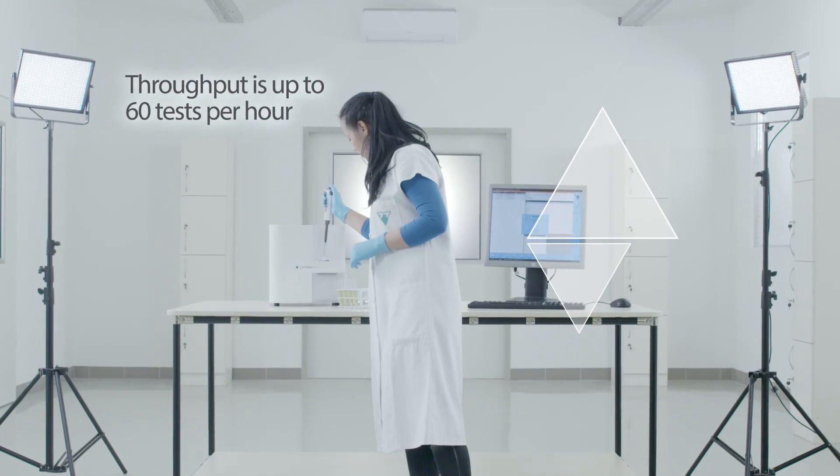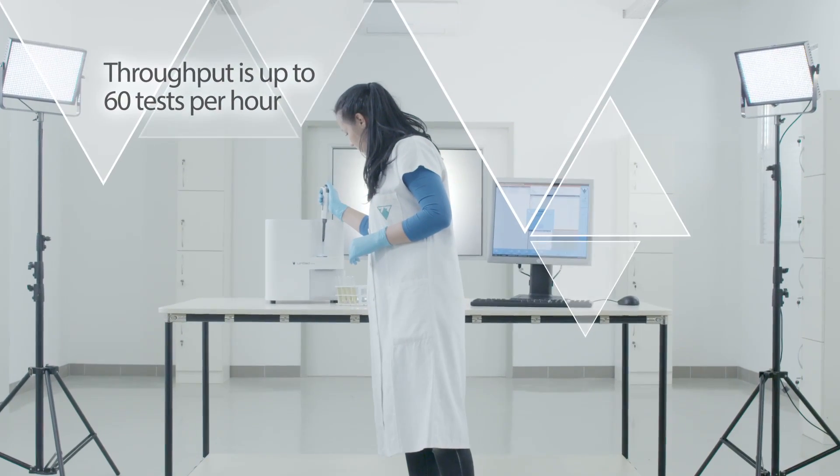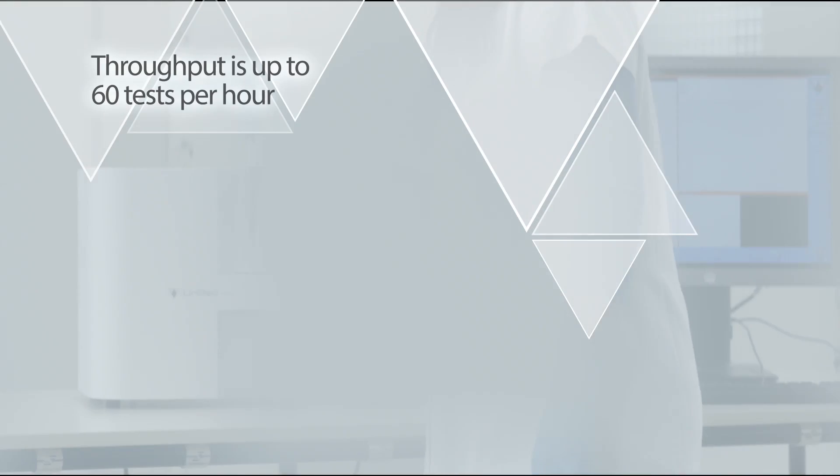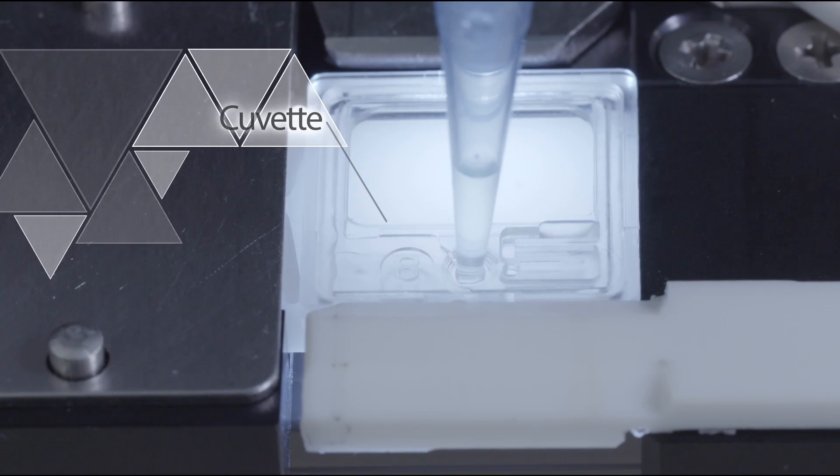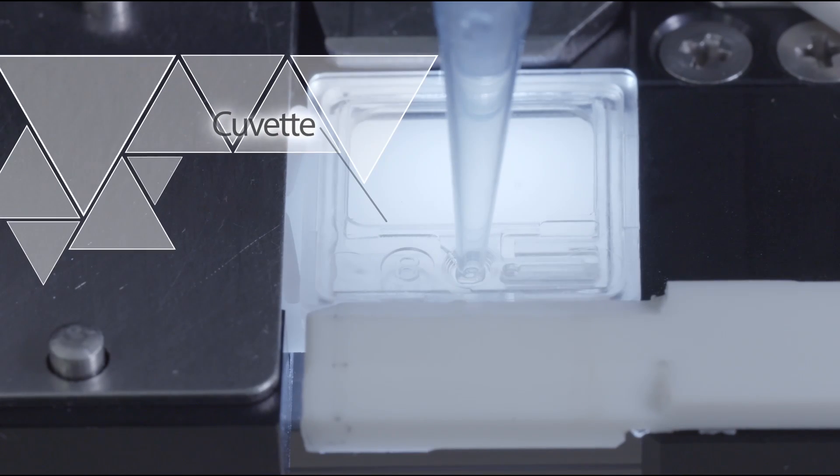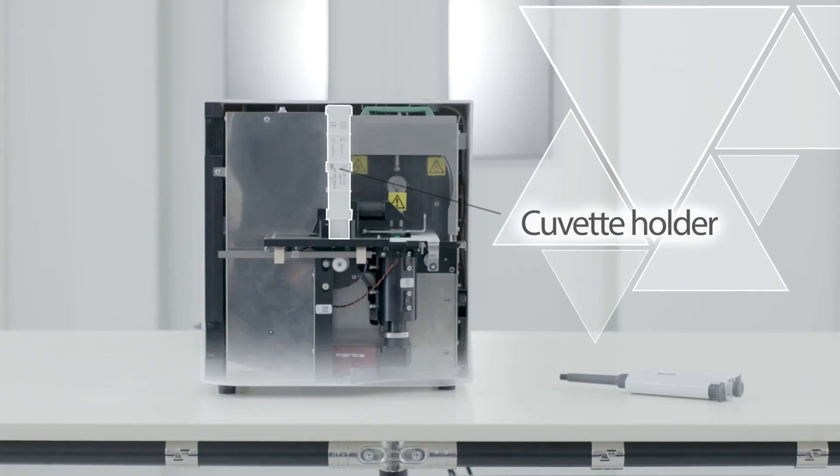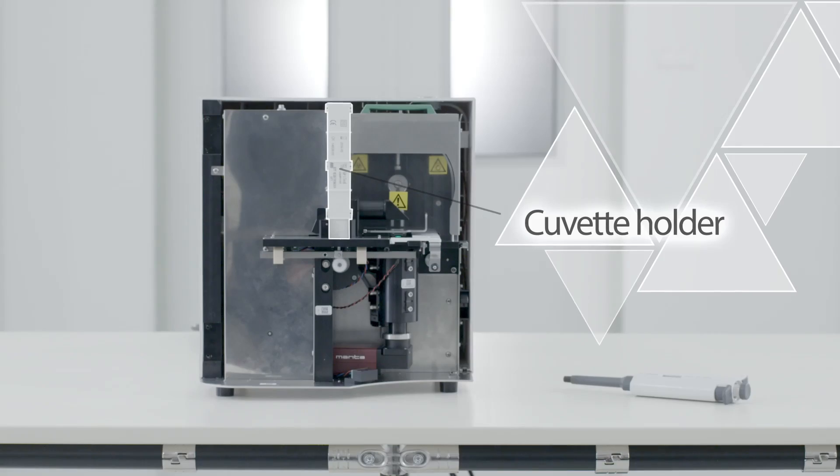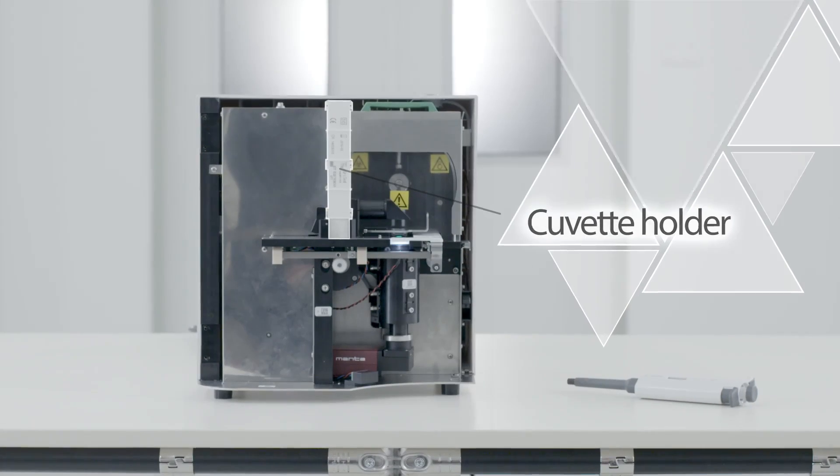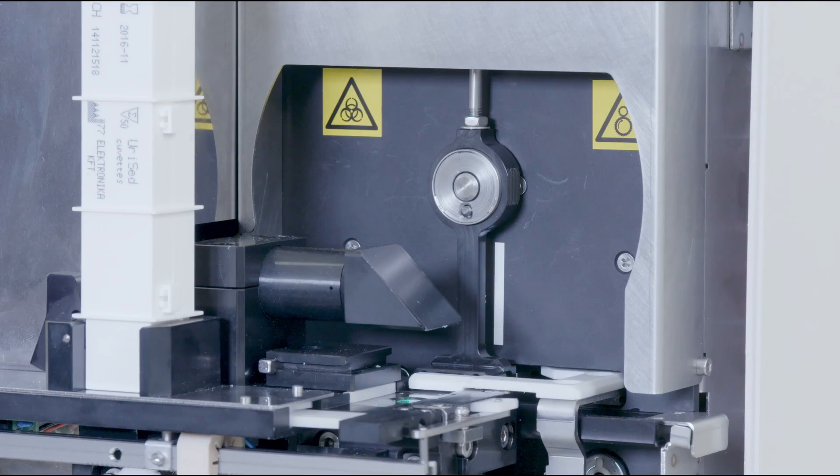The throughput of URISED Mini is up to 60 tests per hour, while 15 images are taken from each sample.